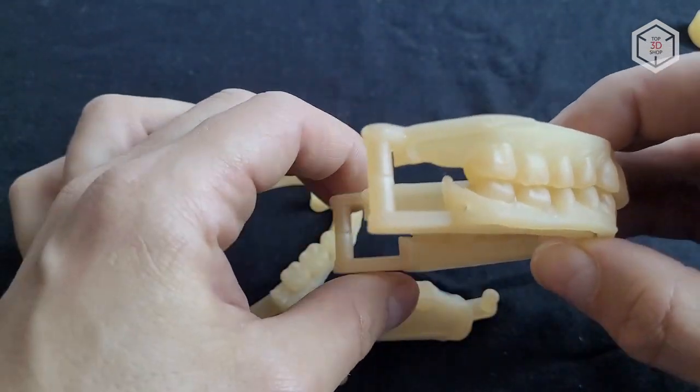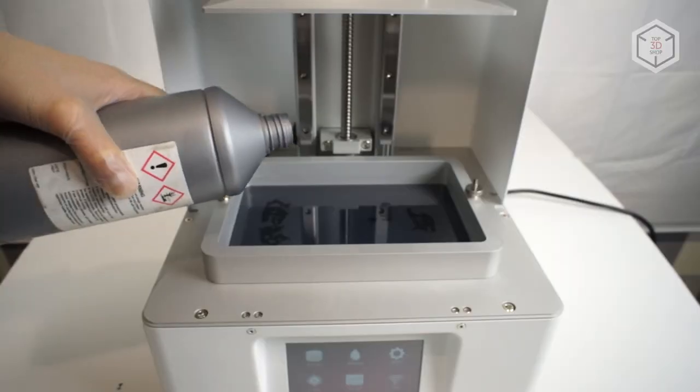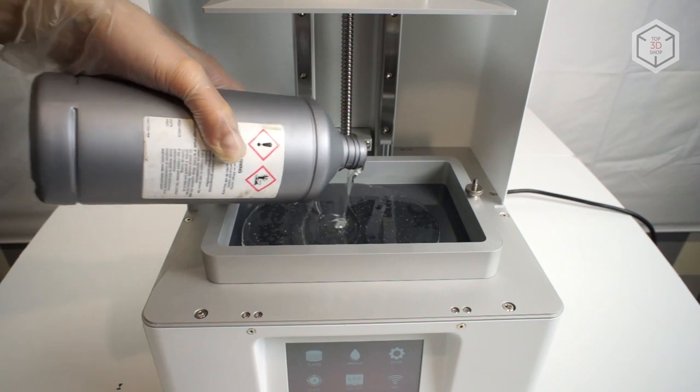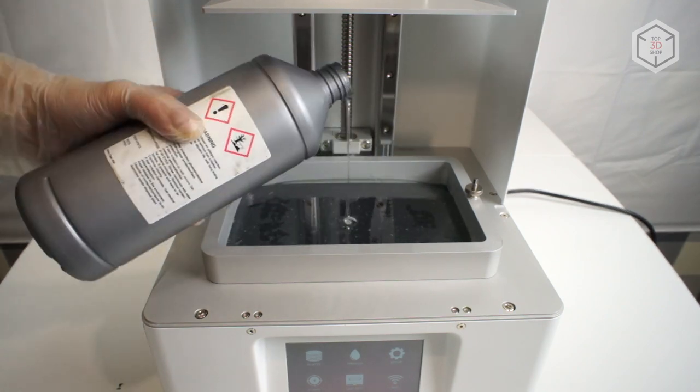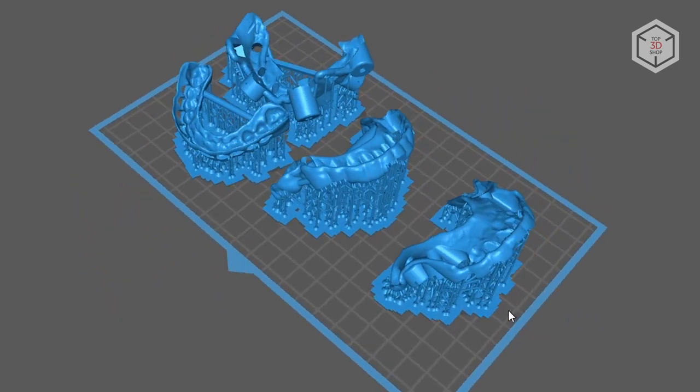This print was also a great success with no distorted geometry and everything clearly in its place. For the following tests, we used NextDent Ortho Clear Resin. It is well suited for printing various surgical templates. Such tools are used during operations in order to clearly understand the procedures and manipulations.